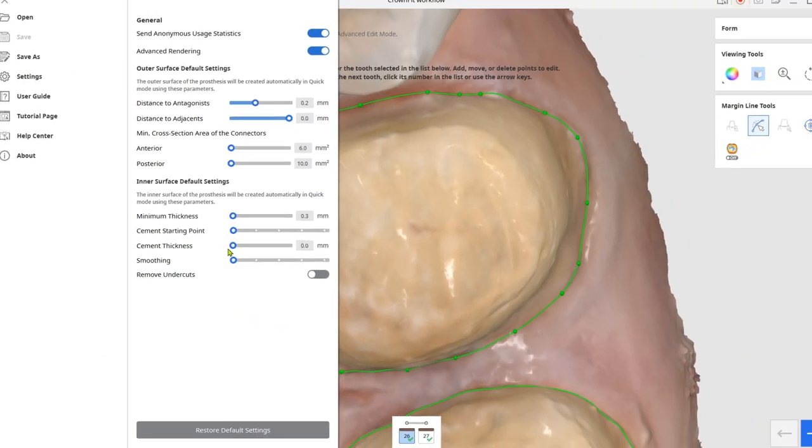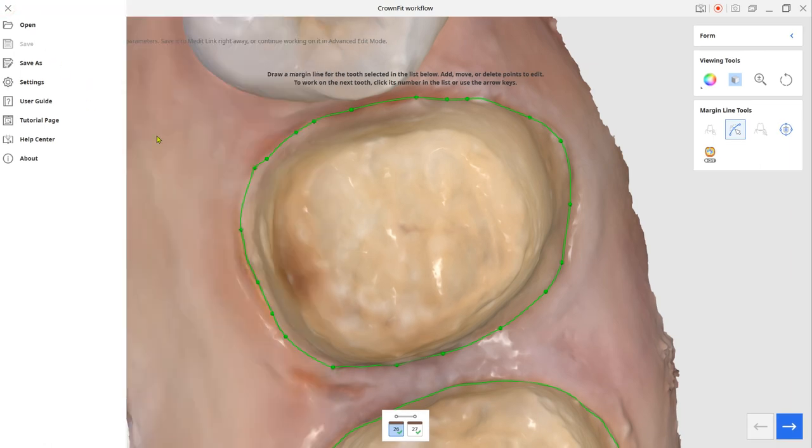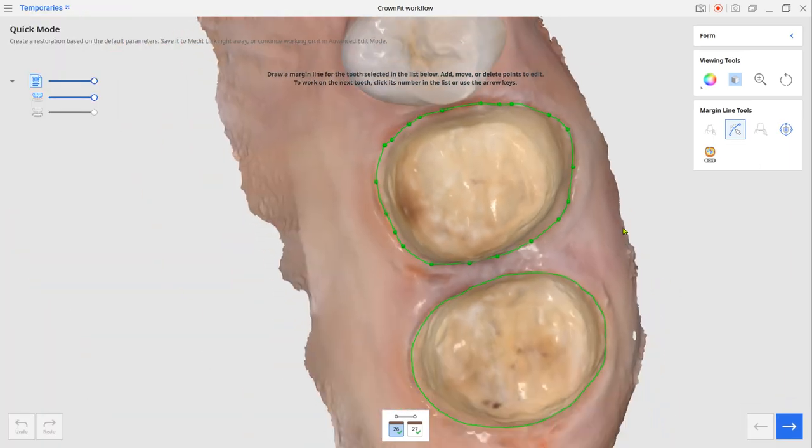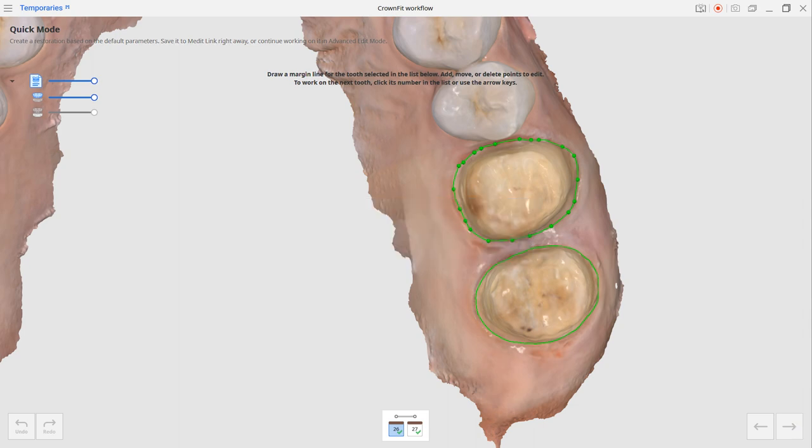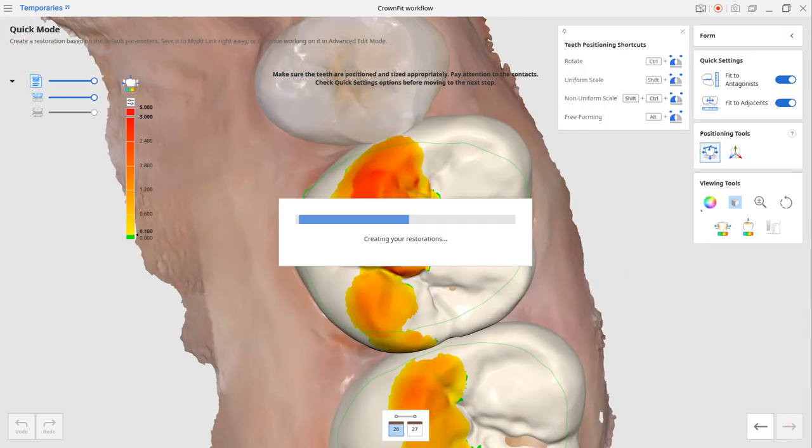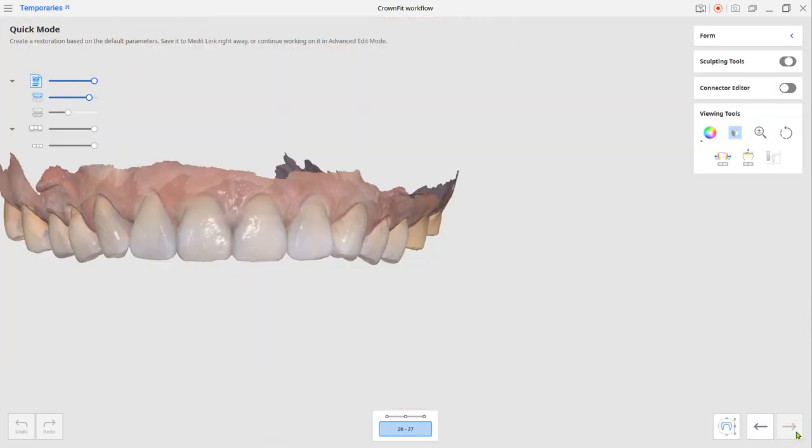Now, we only need the information about the margin location. Click next until the end to save it. You don't need to do actual designing.